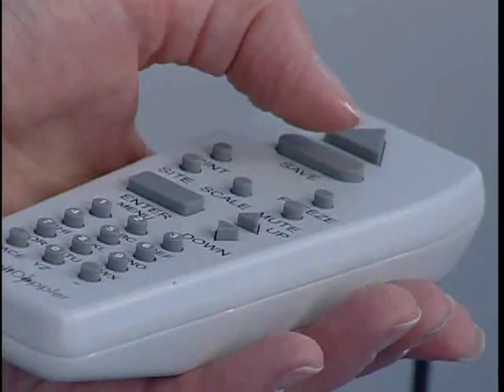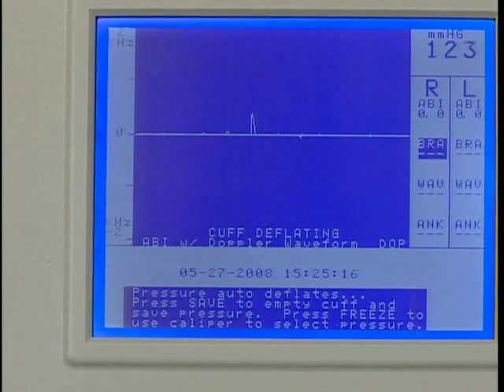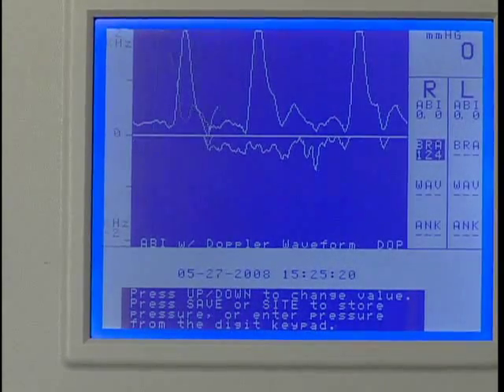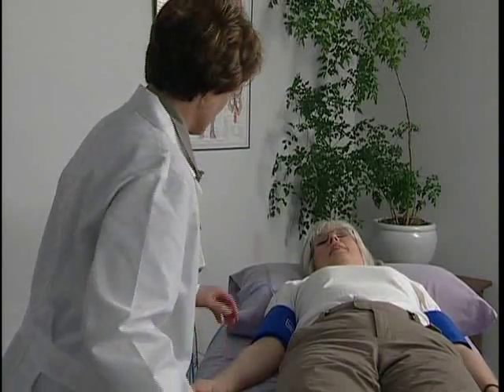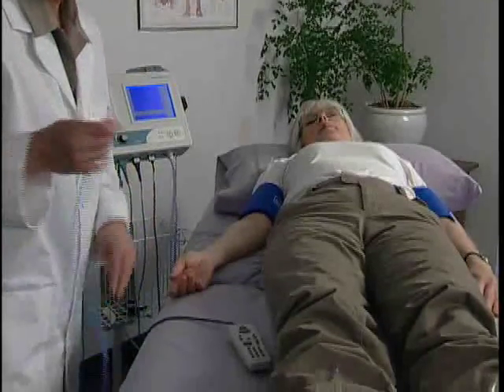Press Save when you hear the first pulsation return. If you were late pressing Save, adjust the pressure reading by using the up or down key. Press Save to record the systolic pressure and the marker will move to the next protocol location. Now we'll obtain a Doppler waveform — move the hose to the right ankle cuff.